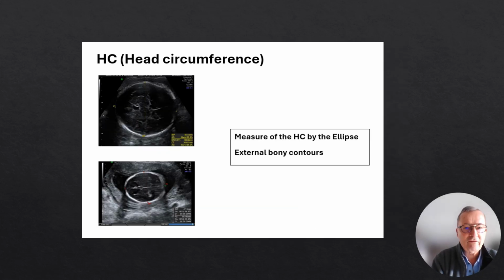Regarding the head circumference, as you can see in the two images, the calipers used are an ellipse, carefully following the contour of the skull.